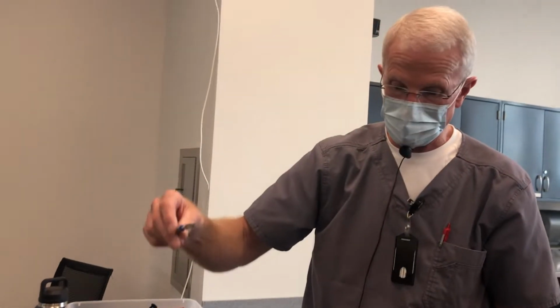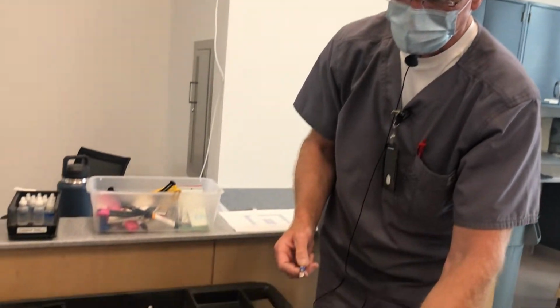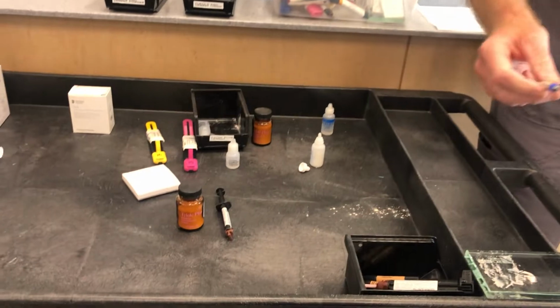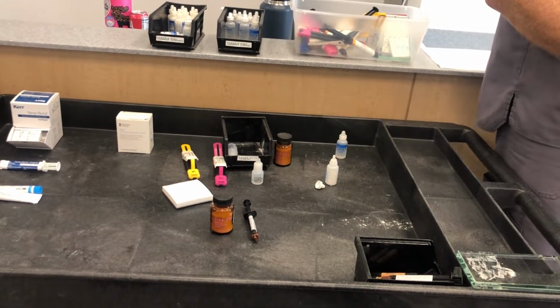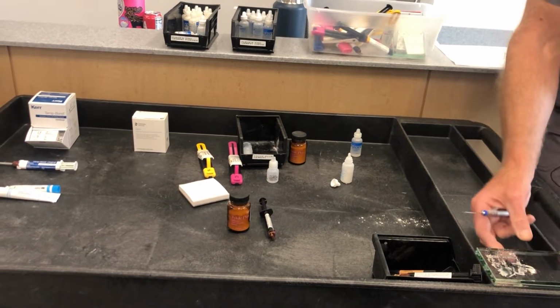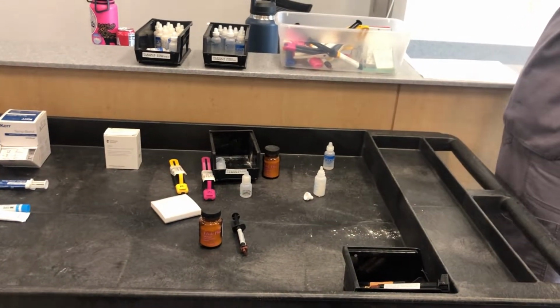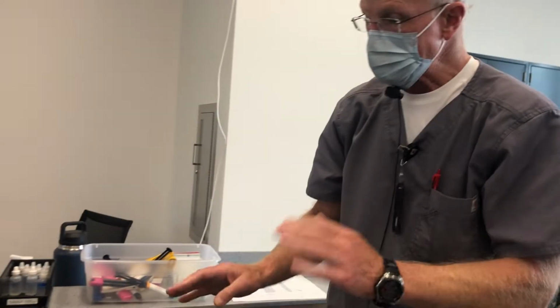Now, when you've got it to this point, you want to clean it up, because if you let it sit on the glass slab, you won't get it off. So if somebody will grab me a tissue, a towel, or a 2x2 sponge, we'll clean this off, and then I'll let somebody wash it off into the sink, because it is water soluble. Somebody take and just wash that for me, and I'll give you this too to scrub it with. Thank you.